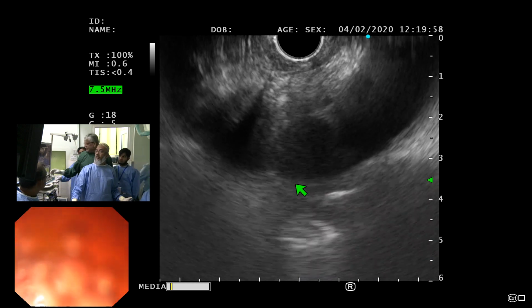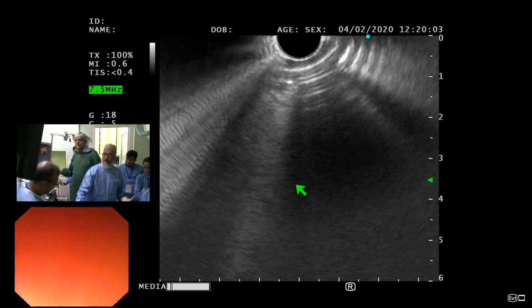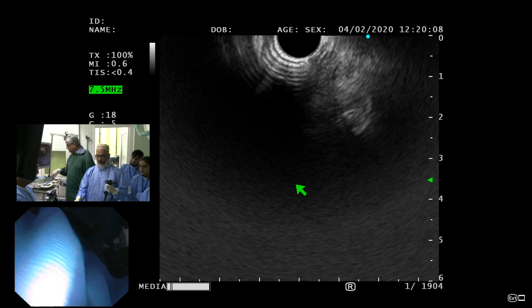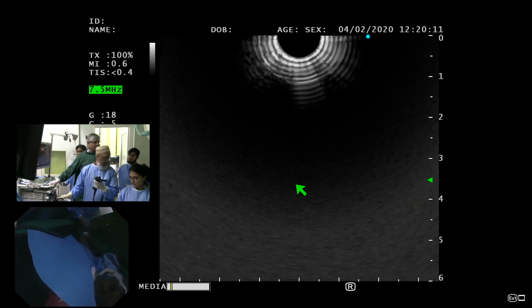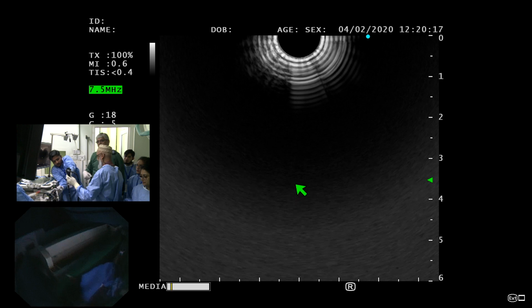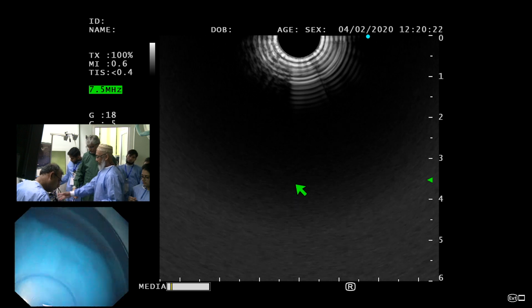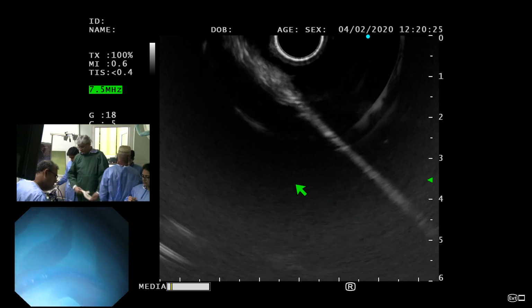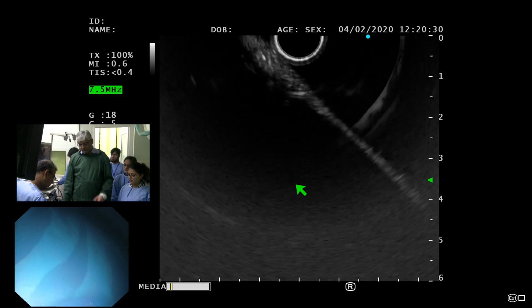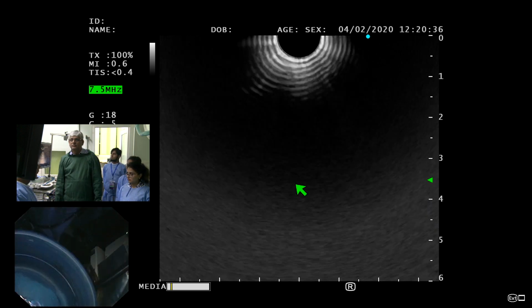So how often do you see these lymph nodes that are slightly larger than the expected one? निकाल दो. हाँ. It's variable. It depends upon the underlying condition. No, I see. Just when you're doing your endoscopy where you don't expect subcarina, slightly larger lymph nodes, inflammatory looking lymph nodes, we see them not that infrequently. Not all that uncommon. Especially in the winter season, when lots of flu patients are around, we do come across lymph nodes, roughly about 0.7 to 1 centimeter in size, benign looking.